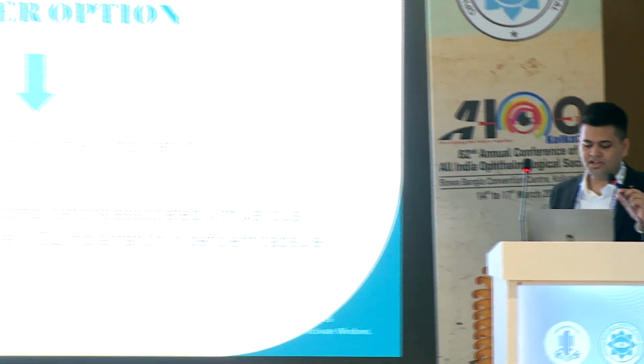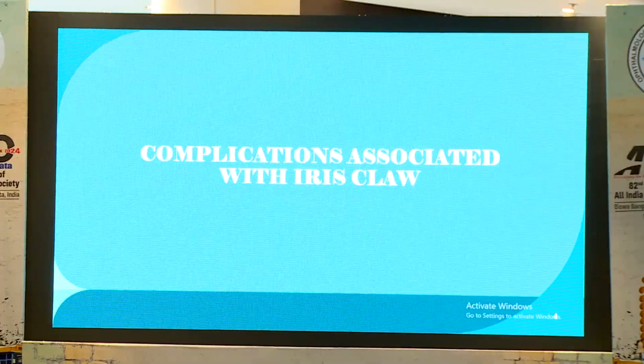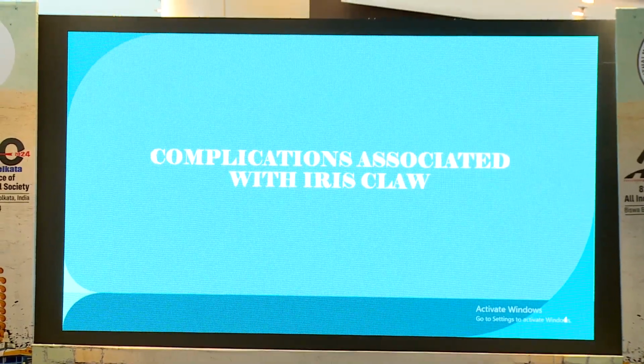For a retropupillary iris claw, we have to choose the better option in deficient capsule, in respect of safety profile with minimal complication. So it is important to assess the complications associated with the various options available for secondary IOL implantation. Now, one by one, the discussion about the complications.